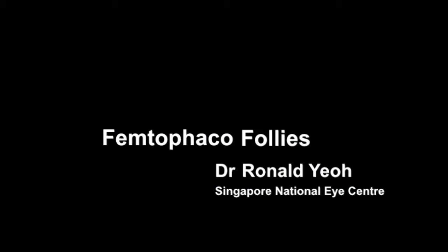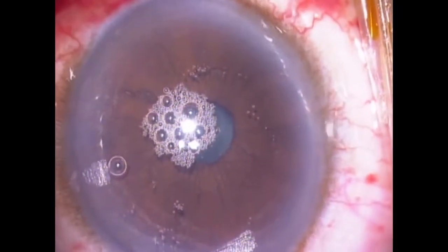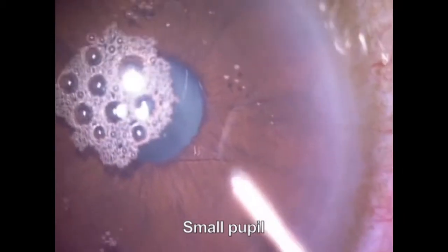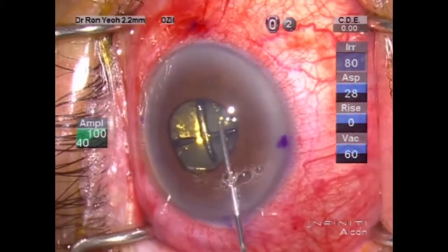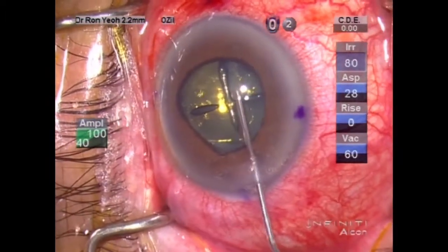On days like these, the first difficulty encountered is that of pupillary constriction after the femto step. Here we see the myosed pupil peaking the cut capsule. The completeness of the CCC is hard to ascertain, and nucleus removal is harder. The use of OVD to open up the pupil works in most cases.